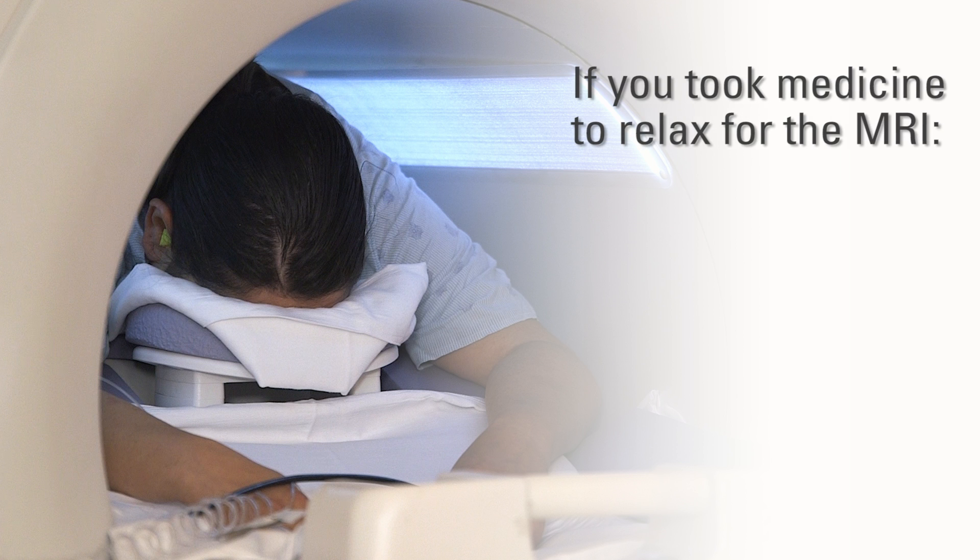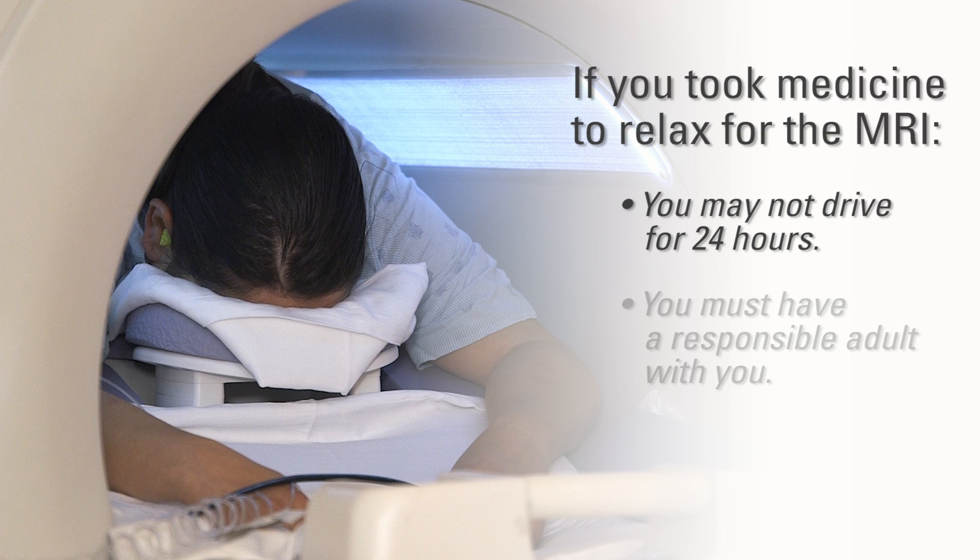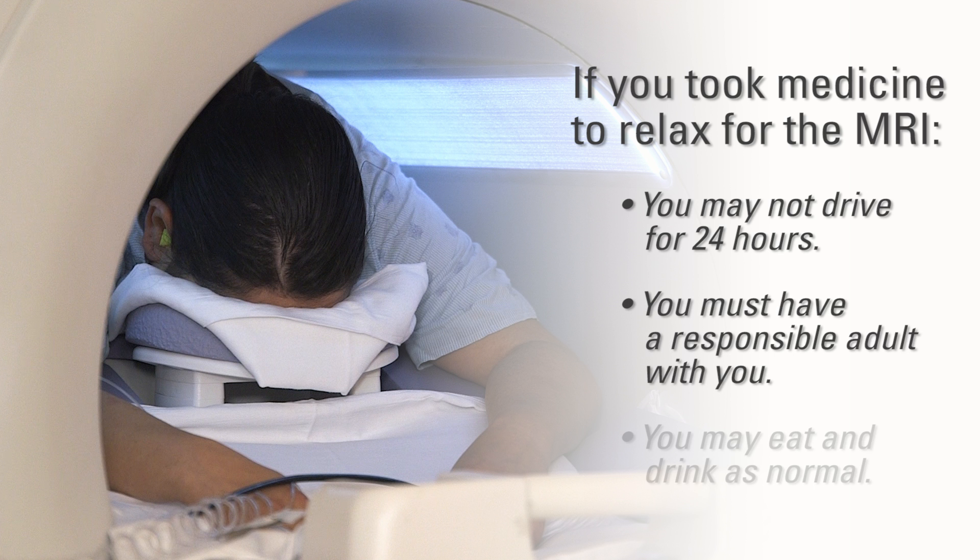If you took medicine to relax for the MRI, you must follow these precautions afterwards. Do not drive for 24 hours and have an adult drive you home. You may eat and drink as normal.